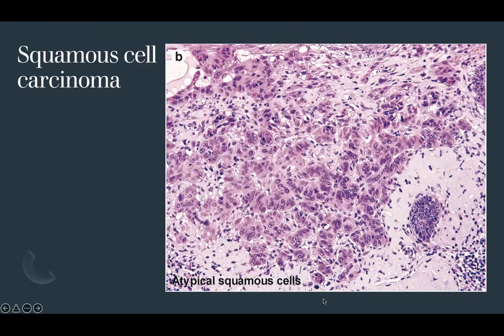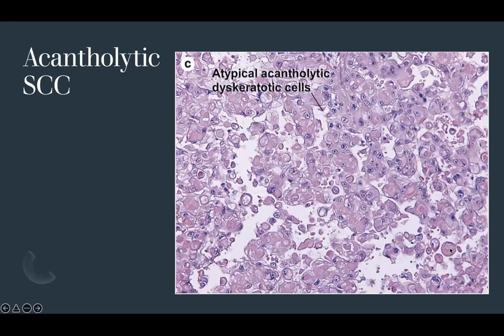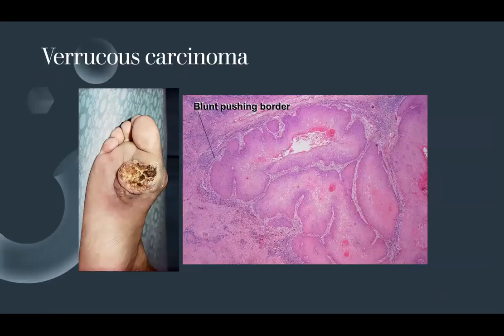Here is an example of invasive squamous cell carcinoma showing nests and infiltrating populations of atypical squamous cells invading into dermis heavily covered in solar elastosis. Acantholytic SCC shows abundant acantholysis between highly dysplastic atypical keratinocytes — a large breaking apart of cells with individual cells that are highly dysplastic.